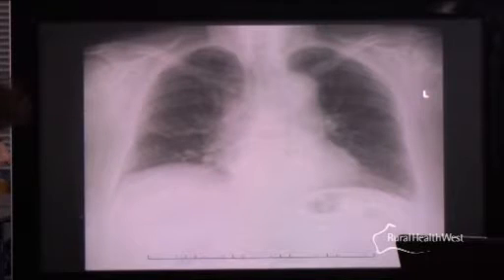But could you talk us through her chest imaging and the sorts of things that you saw? Sure. So this is the PA chest film which is being performed, and you can see in this particular case it's poorly inspired, but it's not because the patient hasn't tried to take a deep breath, it's because the patient can't take a deep breath. So you would probably get a note coming through from the radiographer who took the X-ray saying, tried twice, as deep a breath as possible, can't do better, and otherwise you can't tell. Yep. So if the patient just didn't try, it would look very similar.